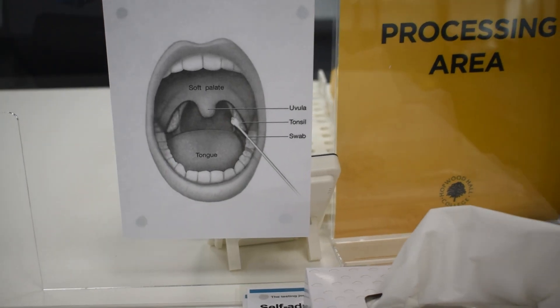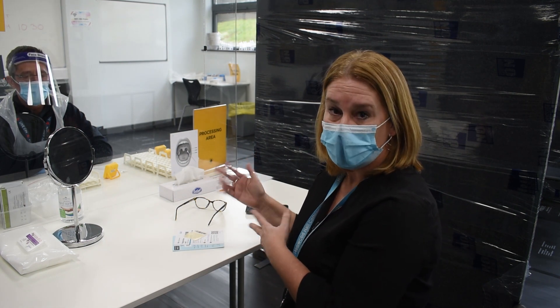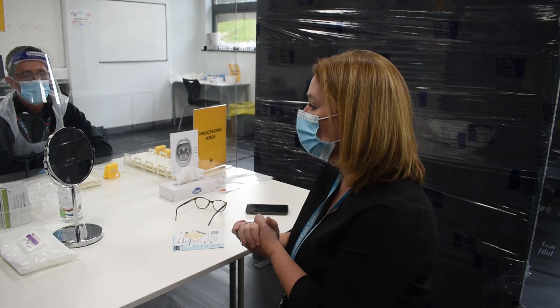I've now been directed to the testing station which is where the actual test will take place. As you can see, there are instructions on exactly how to do the test, but you'll also be taught through the test by whoever is doing the test for you.